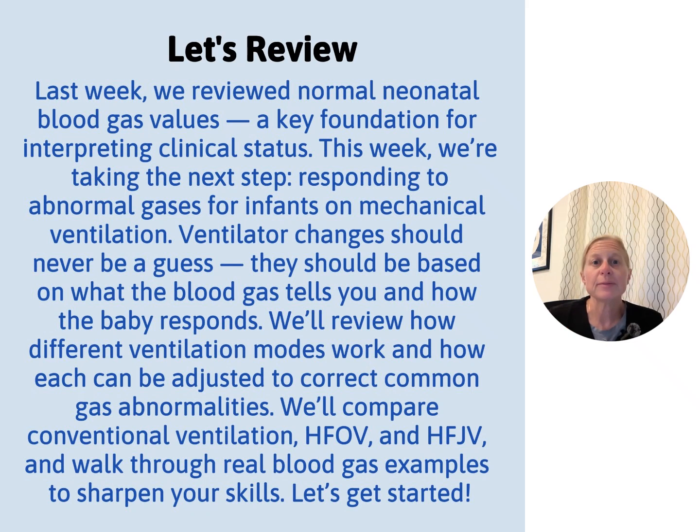I also want to remind you that some of what we're learning are ways you could be using the R of S bar when you're talking to a provider to say, hey, should we change the rate? Should we change the PIP? Should we change the amplitude, right? Or when they say, I'm going to change the amplitude, you understand why we're doing that so that, most importantly, you can explain it to the families. So that's our goal today.